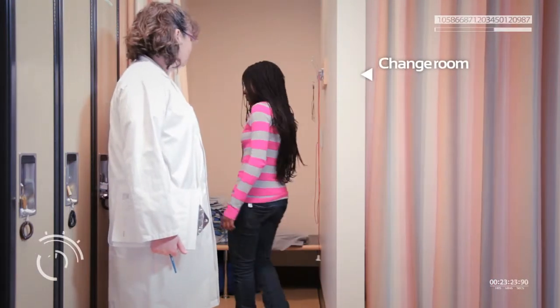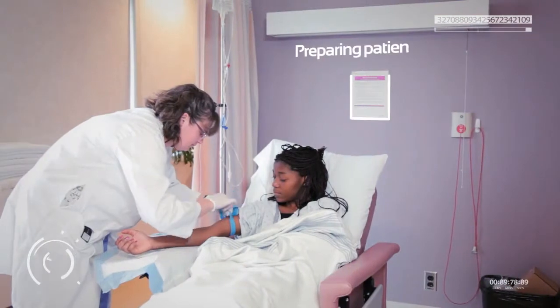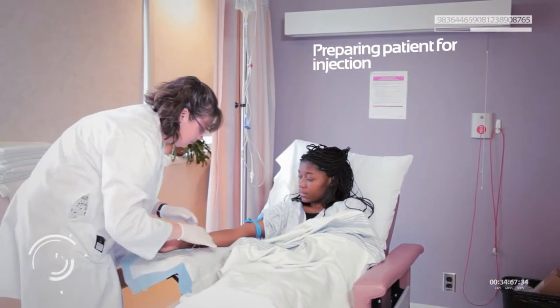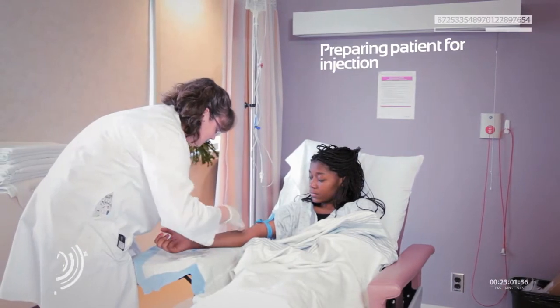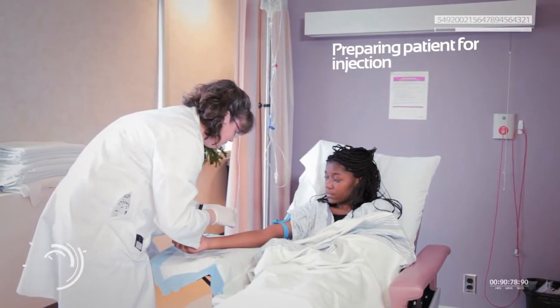I got changed into some comfortable clothes and then it was time to prepare me for the injection. In my case they just pretended to do it, but in real life they would set up an IV line into the bloodstream so they can inject me with radioactive sugar.